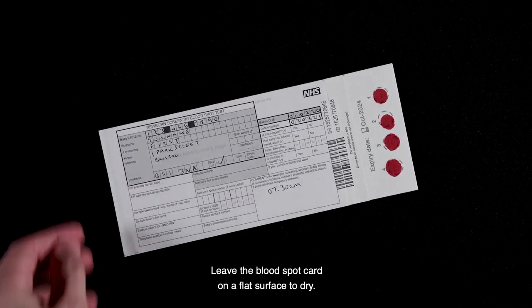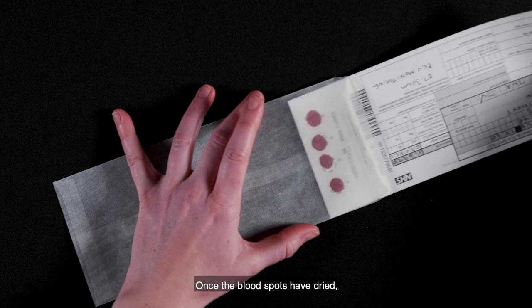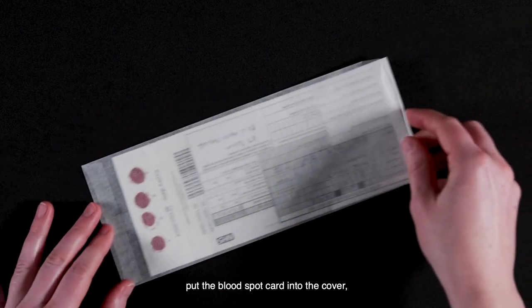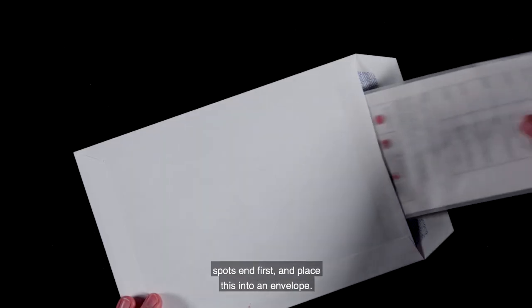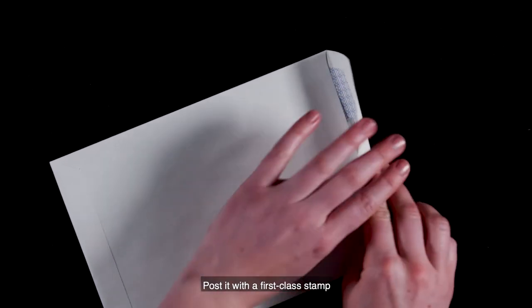Leave the blood spot card on a flat surface to dry. How to post the blood spot: once the blood spots have dried, put the blood spot card into the cover, spot end first, and place this into an envelope. Post it with a first class stamp to the address you have been provided.